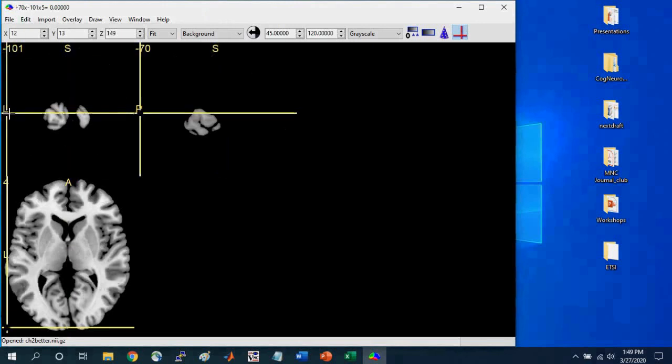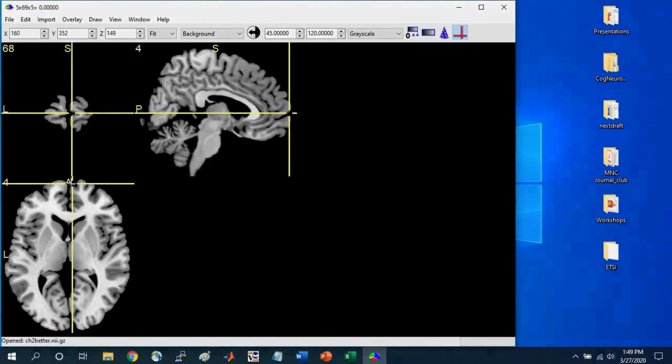L means left, right here. And A means anterior, okay? So these are important to help give a sense for where you are in the brain when you click on a particular orientation.